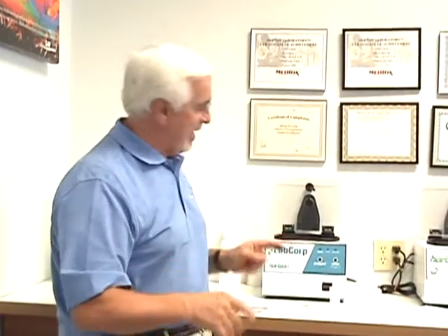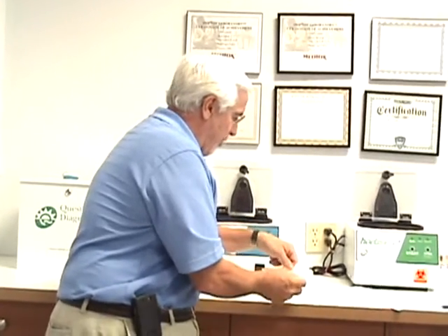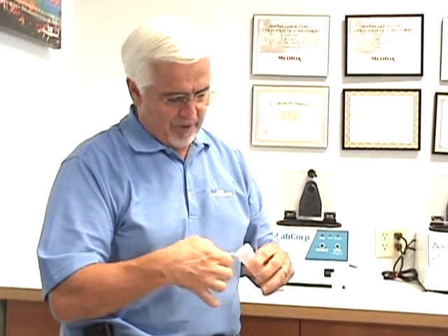It's kind of difficult to write there, and we understand that. But now we know that something else didn't happen, the phone didn't ring, somebody didn't get called from another room, anything like that. We know that that was sealed at the time it was collected and it was signed for. Okay? Now, there's no way for me to take this off without damaging it. I'm going to try to get it off. Oh, look, it tears that easy. That's why it's done this way, guys. It can't come off without the laboratory knowing about it.